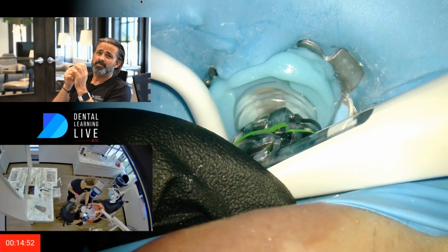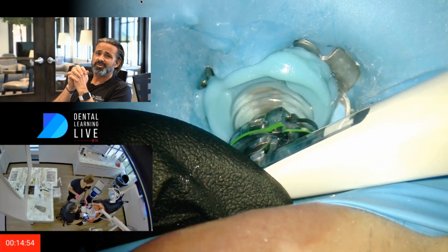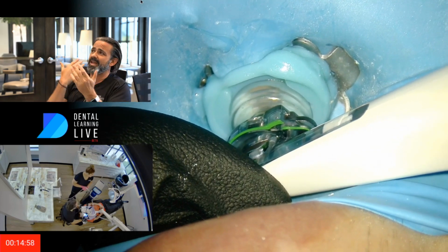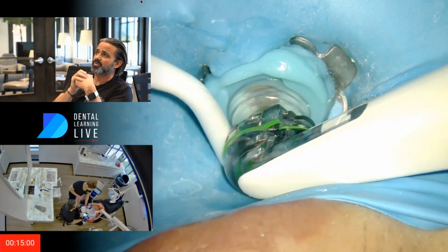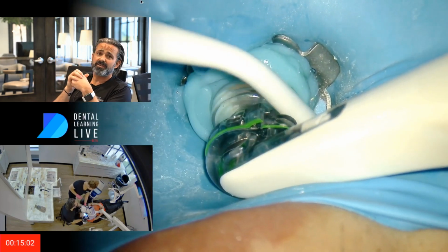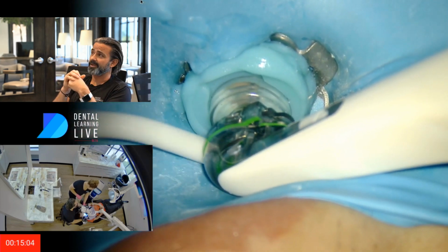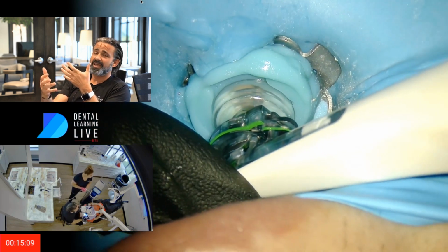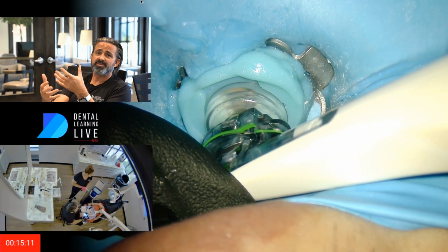And that's why they call it multisonic. It has to do with kind of like white noise. It's just the spectrum of sound, and it echoes, or it goes through the fluid. Sound actually travels faster through fluid than it does air, by the way. And it goes down in a negative pressurized environment. And I'll joke and say it's like it's given the tooth a hickey.